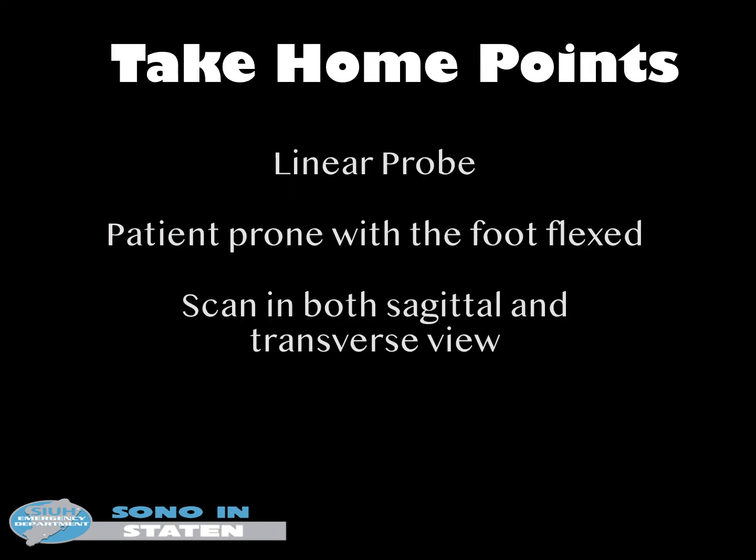So remember, to perform your exam, use your linear probe, have your patient lying prone with their foot flexed, and scan in both sagittal and transverse views. As you can see, ultrasound is fast and cost-effective and provides us with dynamic imaging correlating with patient symptoms.